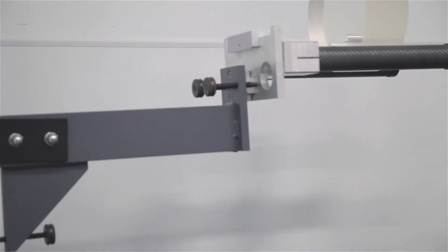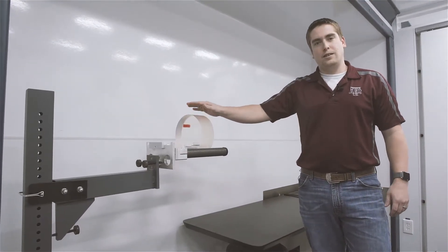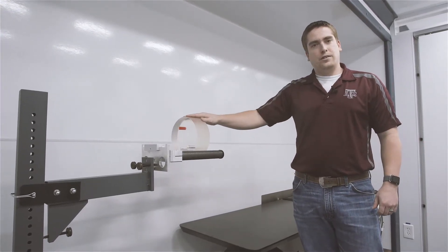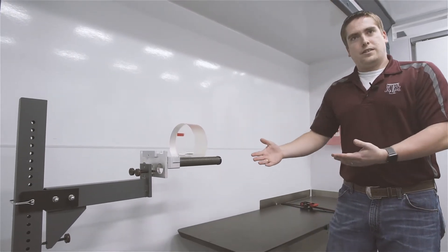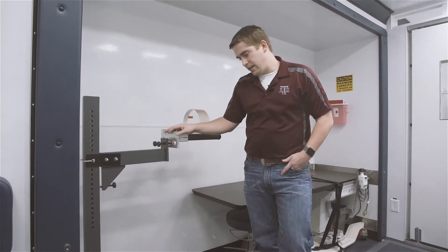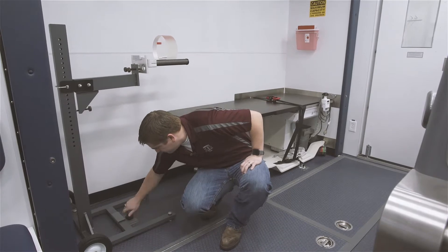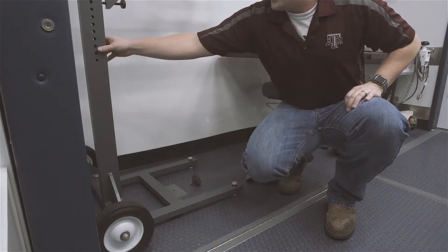We have a stand that holds the QA phantom. This phantom is supposed to be run inside the scanner at the beginning of every shift or at the beginning of every use of the scanner for the day. This helps calibrate the scanner and make sure that the images they're seeing are the most accurate they can be. It requires this special stand to be able to center it properly in the scanner. To keep it secure so it's not banging around, we designed this easy-to-use bracket down here on the floor that comes off with a quick twist of the knob, and then that bracket pops off and this is ready to go.